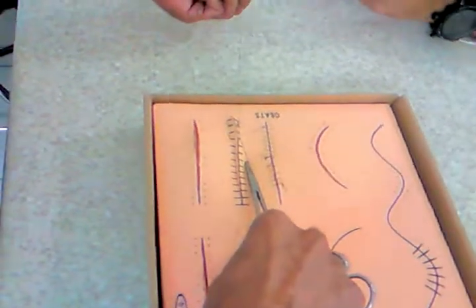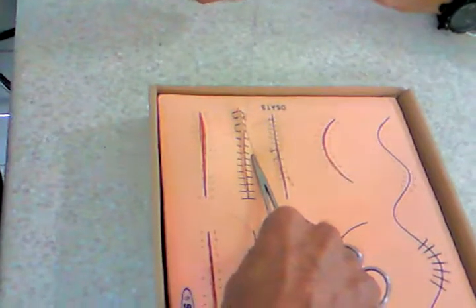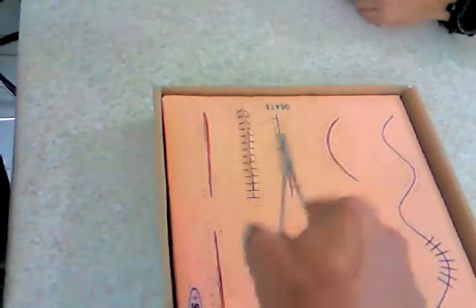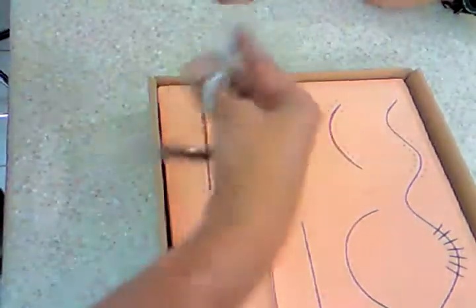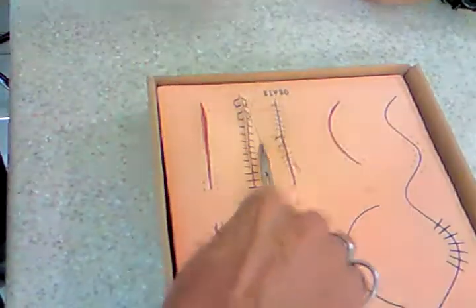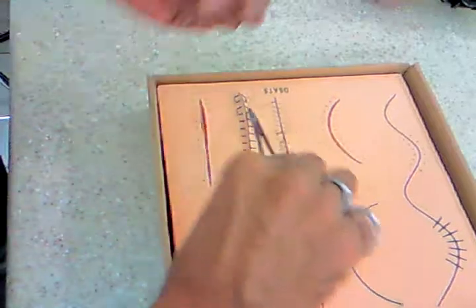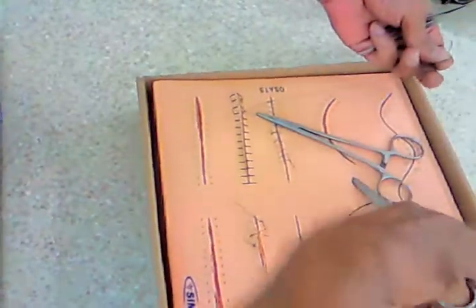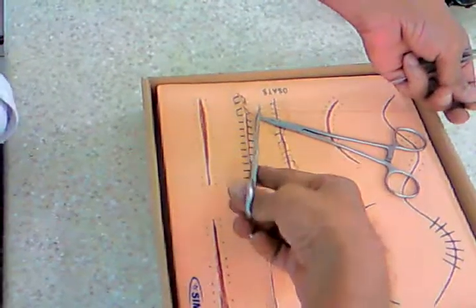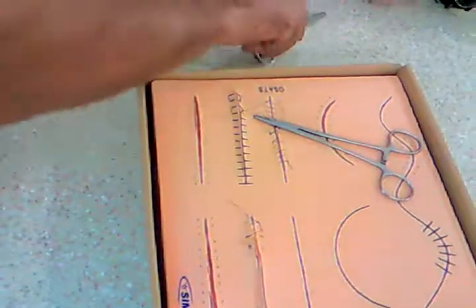This also secures hemostasis. Because I told you, these are used for places where there's an underlying muscle. The platysma, the arteries, they tend to bleed a hell of a lot. So when you're doing this, it secures hemostasis as well as everts the edge. And then I do this. It's not very difficult. So you can do this one. This is the horizontal mattress.